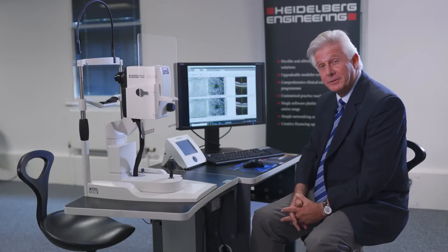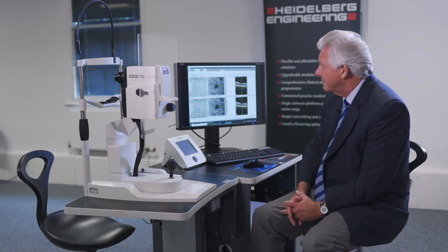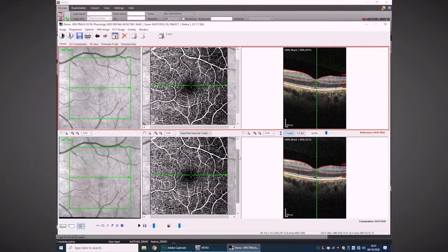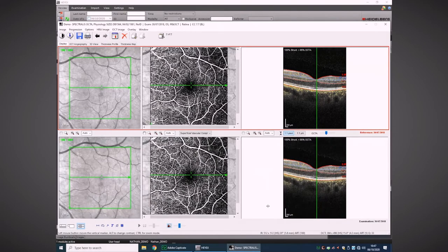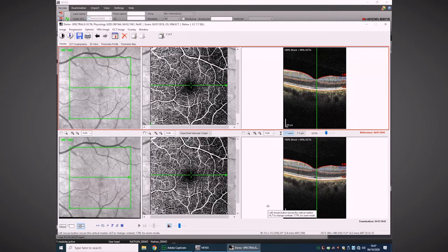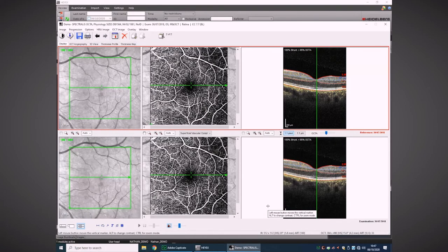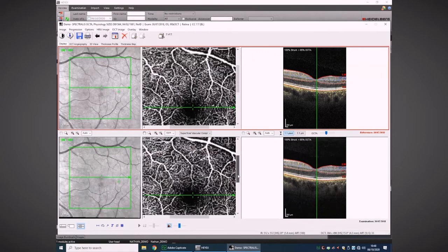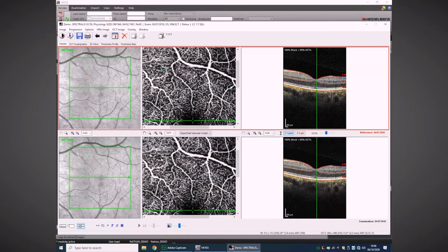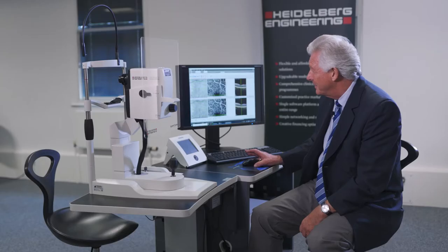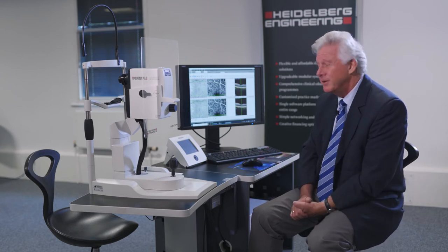Just to show that we're measuring physiology of the body — it's not OCT as we know it and it's not FA either, it's physiology. Here's a patient examined twice within the space of 10 minutes. If you flicker between the baseline and the follow-up exam you can see differences in the OCTA image, and that tells us we're actually measuring physiology. The body is constantly changing throughout the day, so when you sample at one particular moment you might get a different pattern compared to another, and both are normal but they're different.